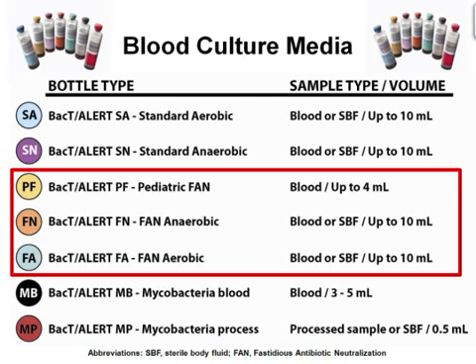One disadvantage is that antimicrobial therapy has been shown to reduce the effectiveness by 71.8% in spiked blood samples. Therefore, blood culture sample collection is recommended before initiation of antimicrobial treatment. This is not always possible in critically ill patients, however, due to high risks of mortality associated with delayed treatment. The red box indicates media supplemented with brain-heart infusion and activated charcoal intended to counteract the inhibiting effects of antibiotics on blood culture yield. These bottles have demonstrated increased recovery of gram-positive and gram-negative bacteria when in the presence of antibiotics.